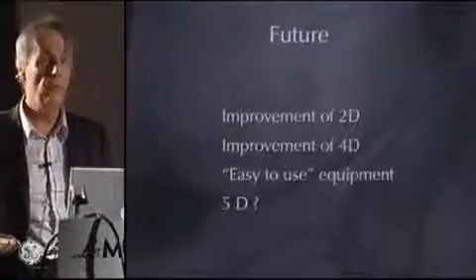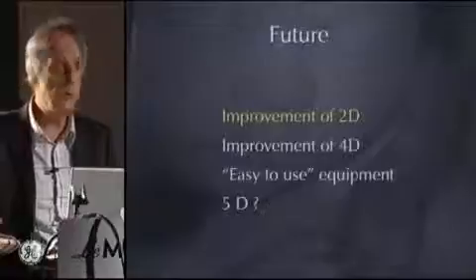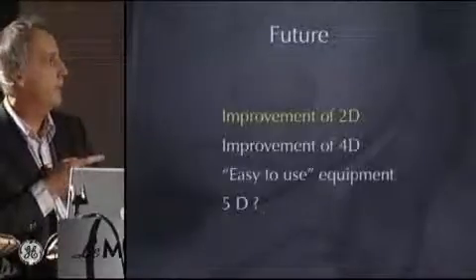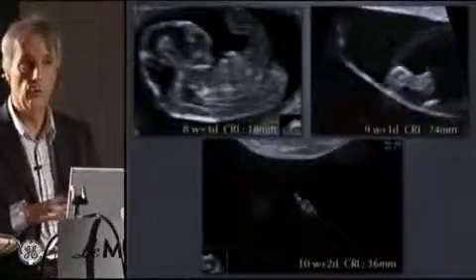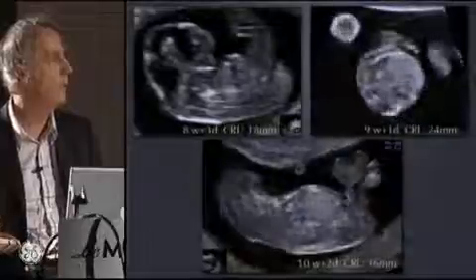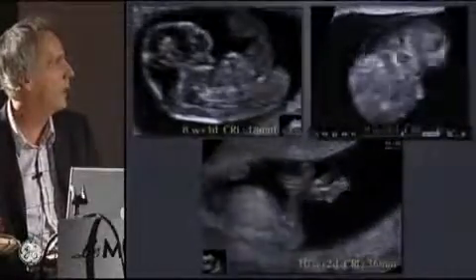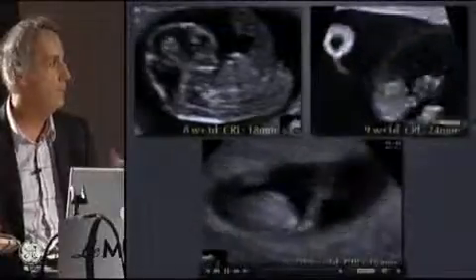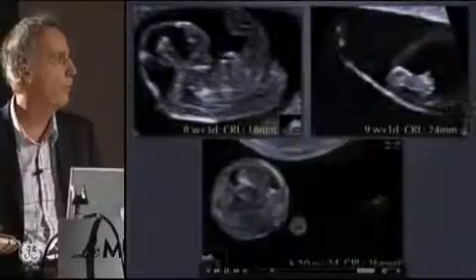And what will be the future for the 3D and 4D ultrasound? First is the improvement of 2D. But I did this slide 1 year ago, and this is not the future, this is today now, because we have now a really high frequency probe. This was made with this high frequency probe. And if you improve the quality of 2D, you will improve also the quality of 3D.